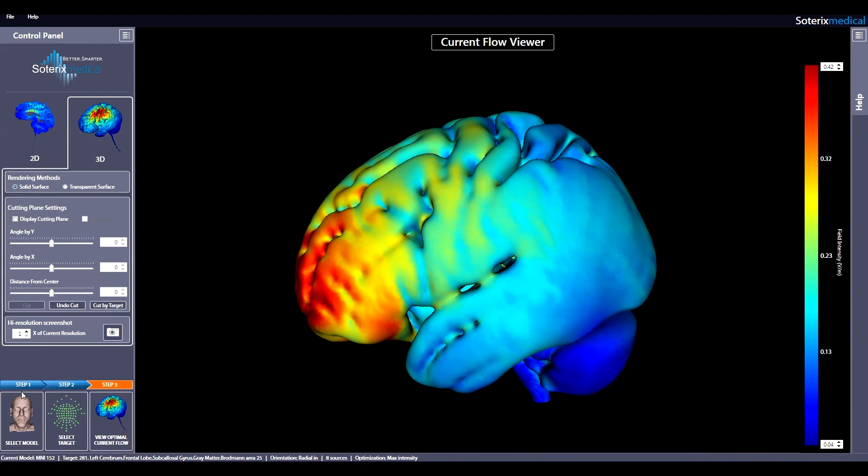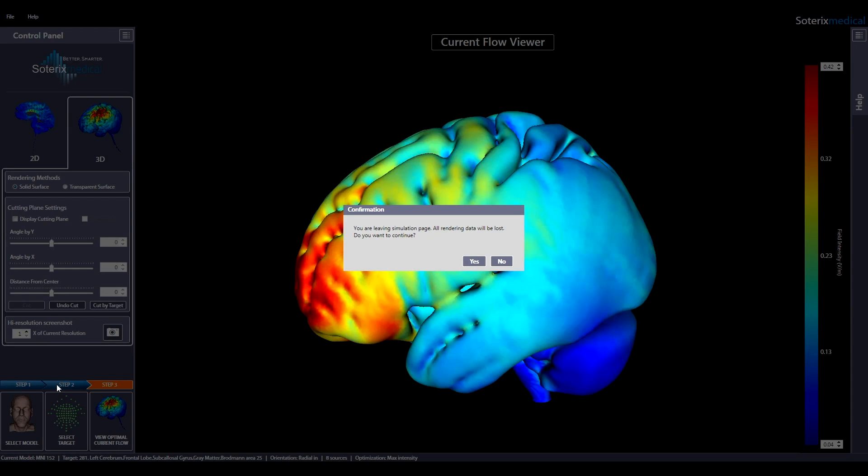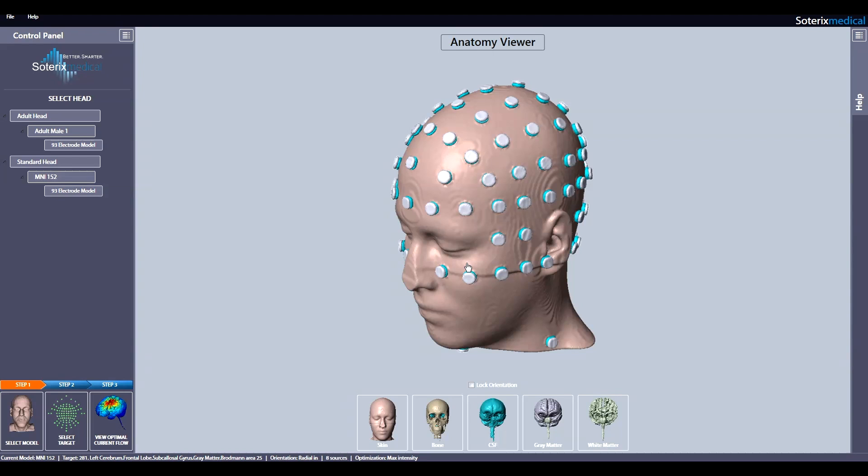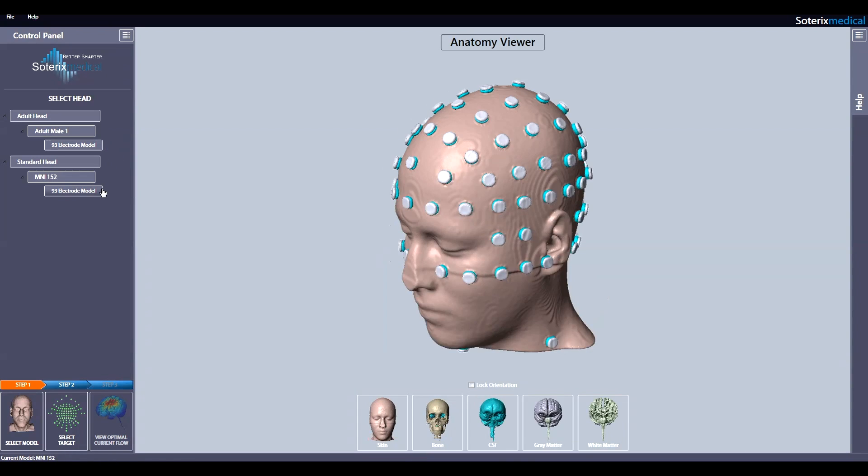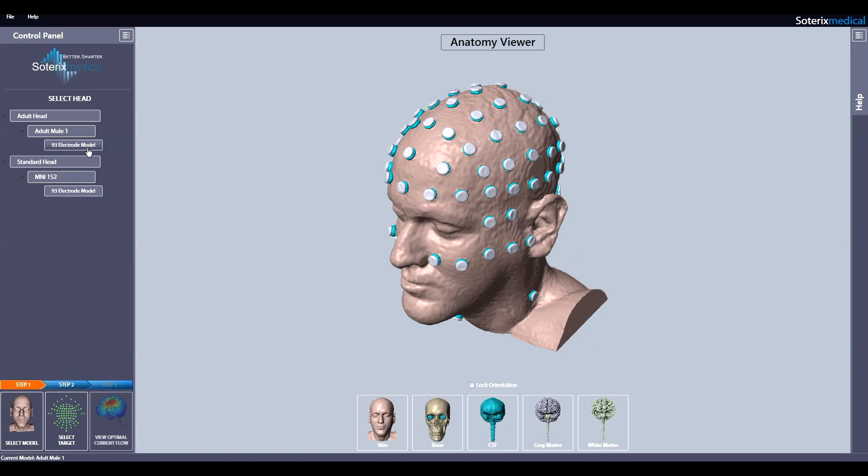Step 1: Your HD Targets will come pre-loaded with one or more head models. In this case, basic HD Targets comes loaded with one adult male head and one standard, or the MNI-152 head. Additional head models available include more adult male heads, adult female heads, pediatric heads, and also heads with lesion, for example, after stroke.